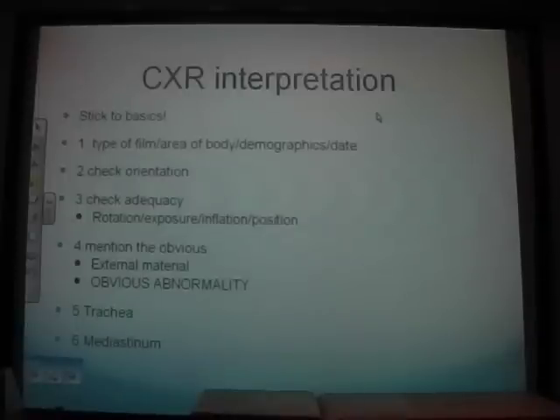You should be able to see everything. Yeah, you should be able to see everything. It's a rubbish X-ray if you can't see the shoulders and you can't really see the gastric bubble, or at least both sides of the bubble.